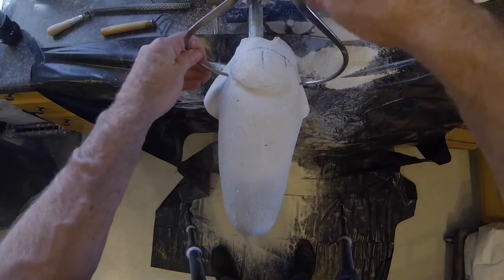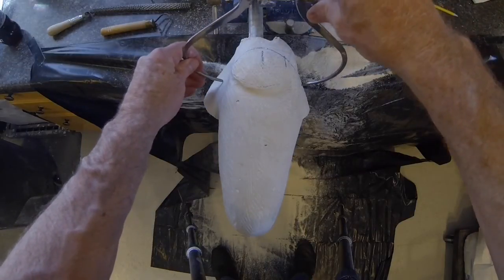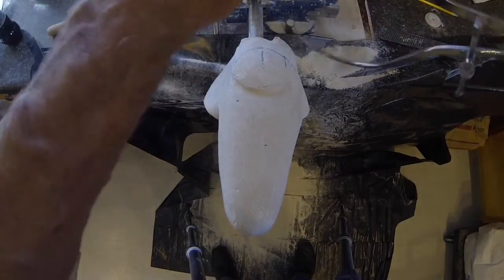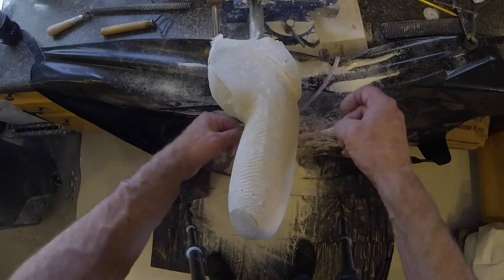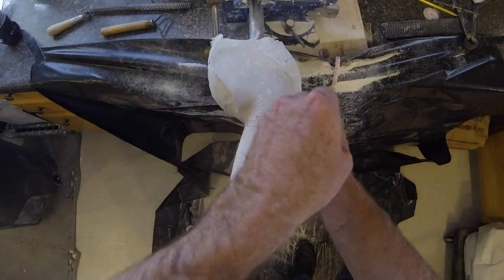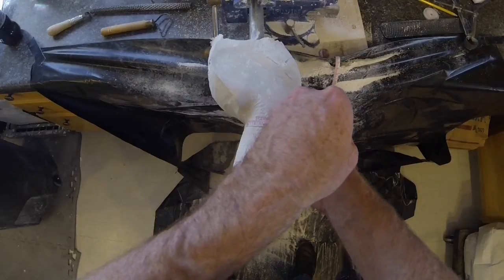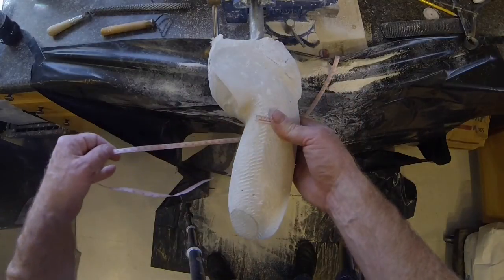Measure the AP of the proximal model. Measure all circumference levels and begin to reduce to desired values.